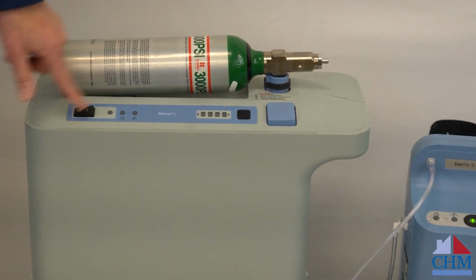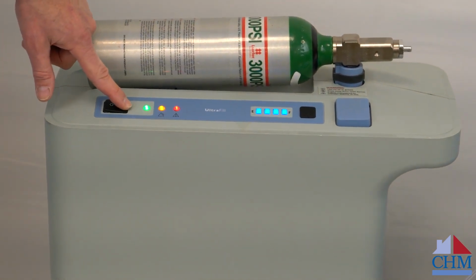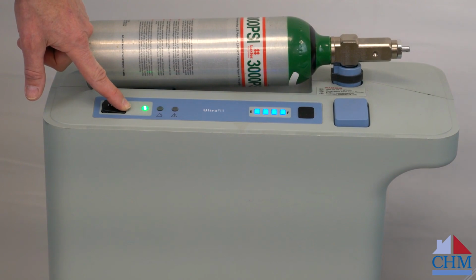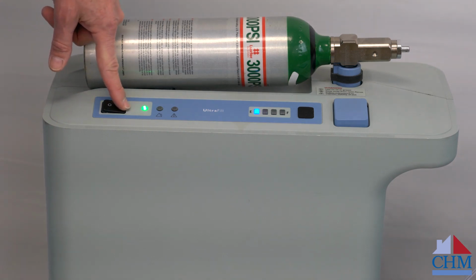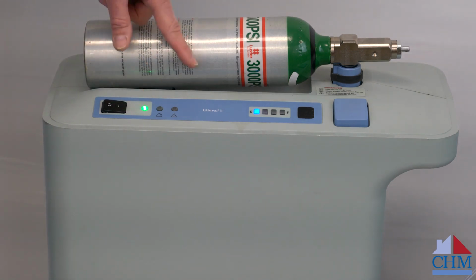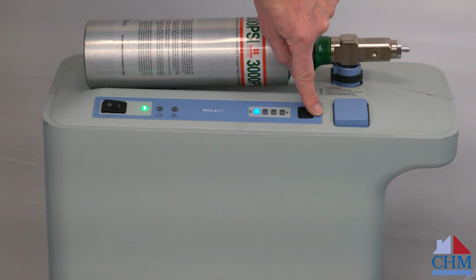I'm going to go ahead and, with my tank attached, I'll hit the power switch on the Ultrafill compressor, and that does not actually start the filling process. So that just turns on the electronics. The next thing I'm going to do is hit this power button. And there's just a black button here. There's not a marking on it.